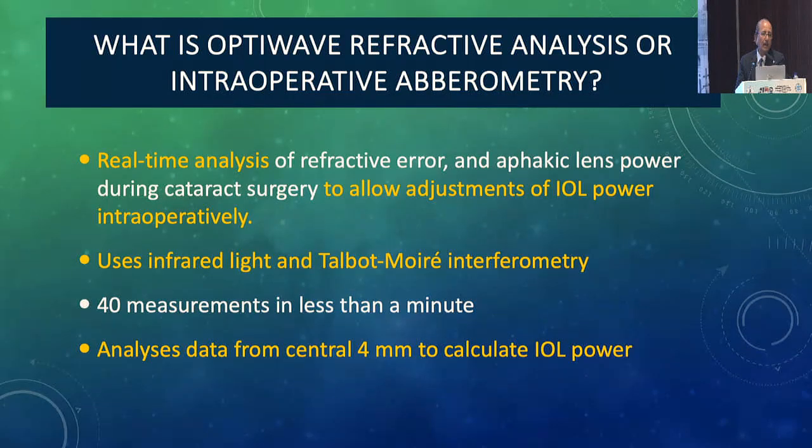Intraoperative aberrometry, or optiwave refractive analysis, ORA, is a real-time analysis of the refractive error and aphakic lens power during cataract surgery, and allows adjustment of the IOL power intraoperatively.